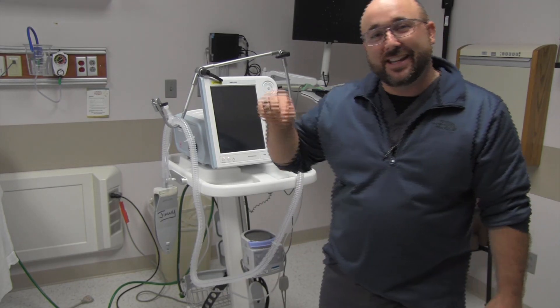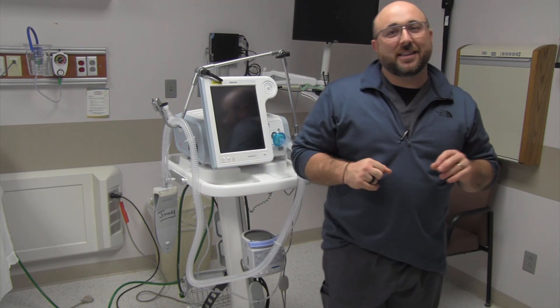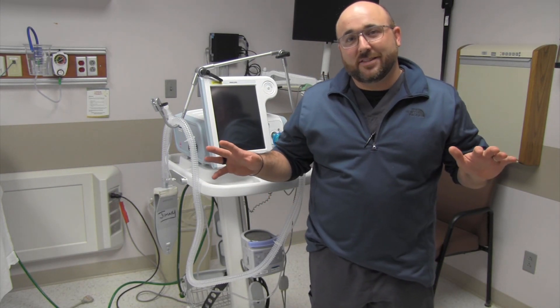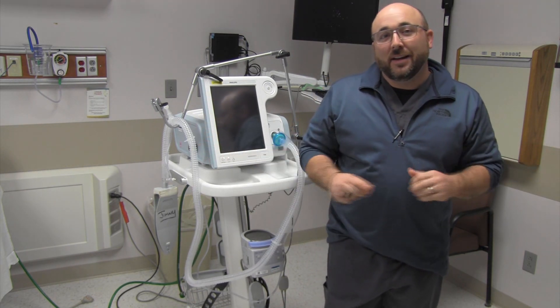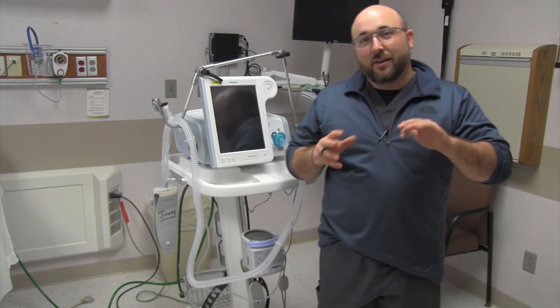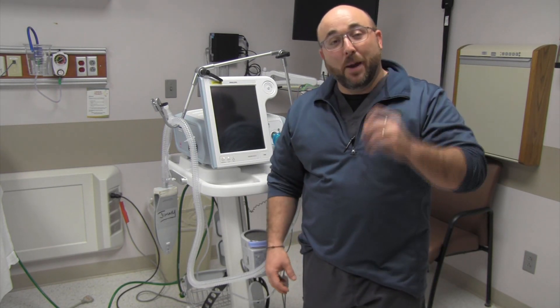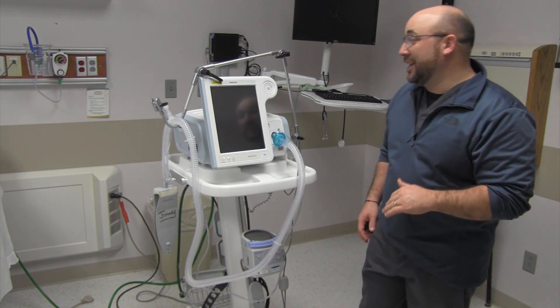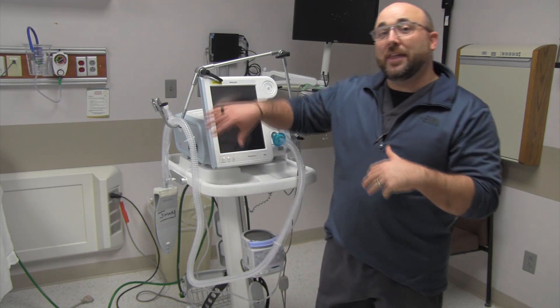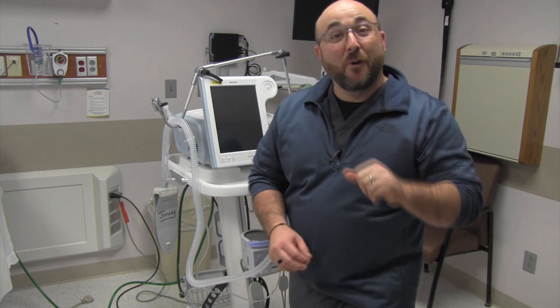Welcome back to the RT Clinic. It's been a while since I put out a video, but I'm really excited about this one. COVID has caused us to think outside the box, and I think that's where us in healthcare really work the best — finding ways to make it better for patients. Today I'm going to be converting my V60 into a heated high flow cannula without the internal hardware attached.